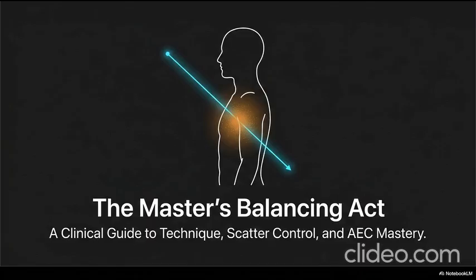As the X-ray beam leaves the tube, it diverges. Spreads out. Right, it spreads out like a cone of light from a flashlight. If you double your distance from the target, your X-ray beam doesn't just become half as intense. It spreads out over a much larger area, becoming 1/4 as intense. Wait, 1/4? Yep. The radiographer has to calculate that exponential drop in intensity and adjust their mAs accordingly, all while knowing that changing the distance also alters how magnified and blurry the internal anatomy will look on the final image.